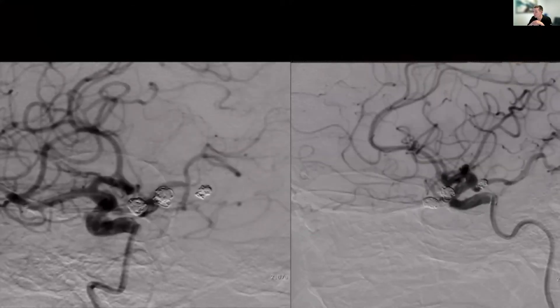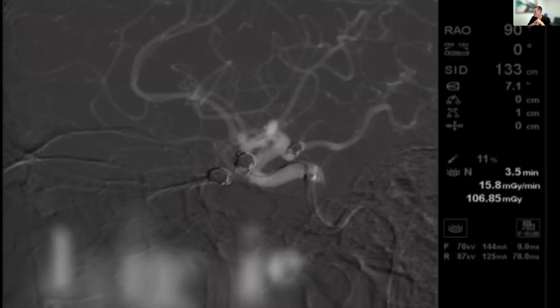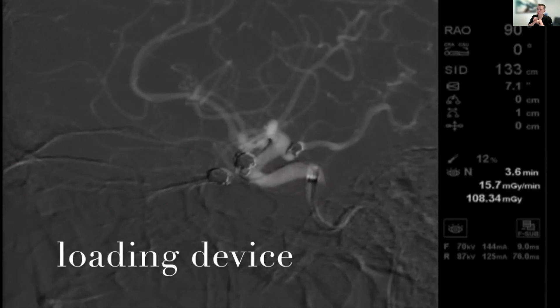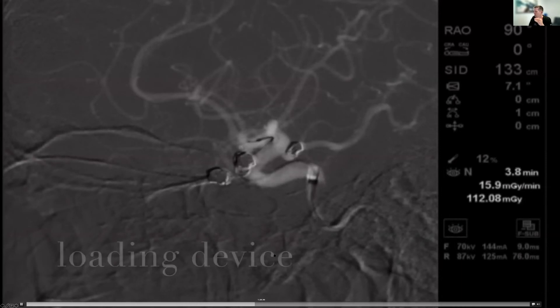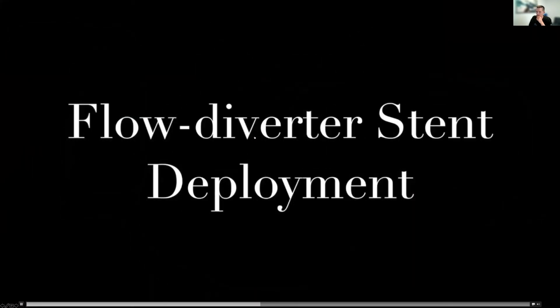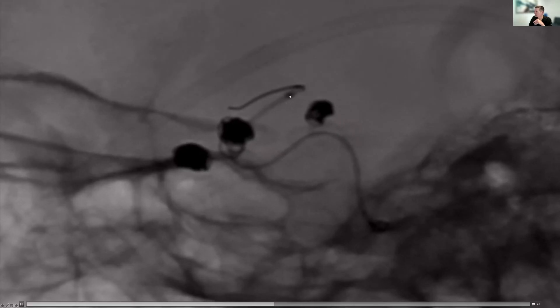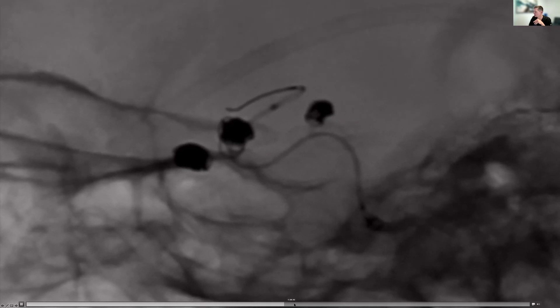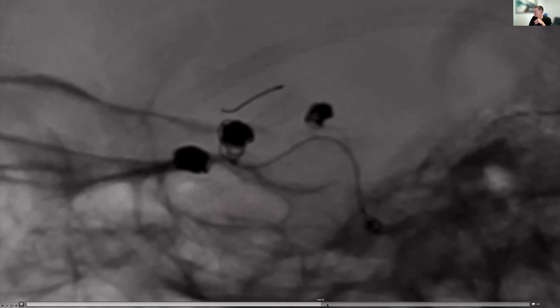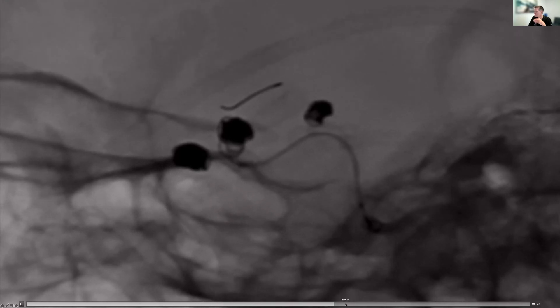We bring our microcatheter up beyond it, in this case into the M1. At that point we're able to come up with our pipeline device, really pushing forward and loading the device to get some forward pressure and get it to open up. There's a 15-millimeter distal wire, and then the stent begins right here. You can see we're starting to unsheathe the stent and get it to start to fluff open, and over time it's going to get good wall apposition.